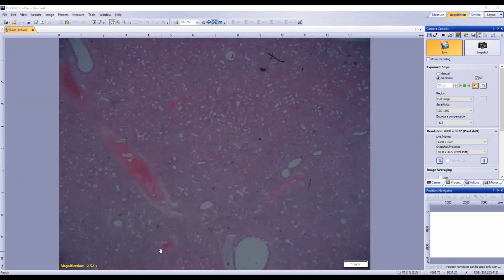So in the middle, you mentioned neutrophils. Degenerate or non-degenerate? Probably a mixture of both. Probably non-degenerate in the middle. Yep. What else are we going to have? So you mentioned fibrin. What are some descriptors that we'd put in a report for fibrin? Kind of eosinophilic, hyaline material.